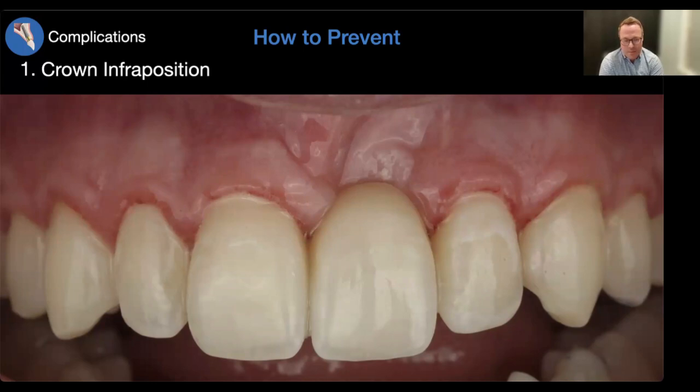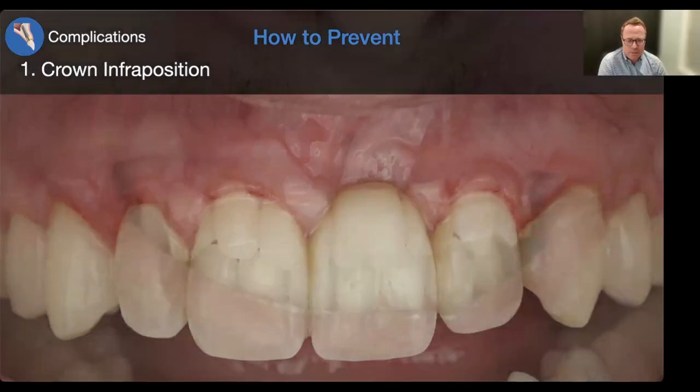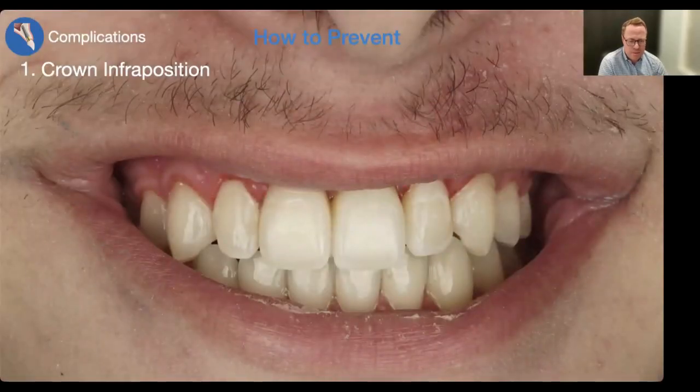But at the same time, this is a great way to replace a tooth, buy some time, and then in the future, they can do the bone augmentation. They can also do the implant, and we can go from there. That's kind of the best option. Obviously, we have to protect the occlusion on this because we don't want excessive forces on that specific cantilevered section, but at the same time, we can get a decent, acceptable result to buy time. And that's the ultimate goal.